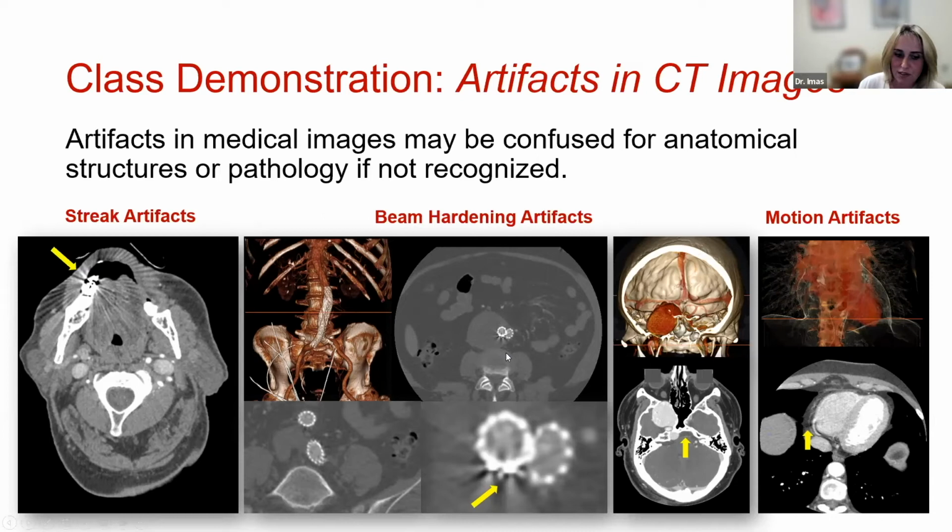But when this becomes a challenge, I have a set of images from the case library as an example. Here you have a patient with quite a large cavernous aneurysm. You can certainly see it over here. If you look at the axial image shown right below it, the red line indicates the level at which that axial image was taken. The yellow arrow points to this area right above it that is slightly darker than the gray of the brain tissue.